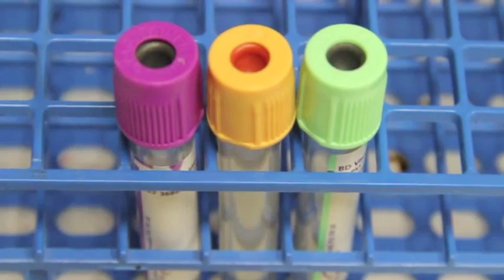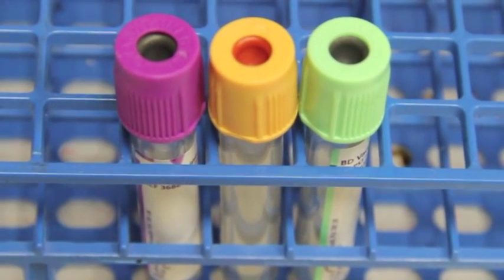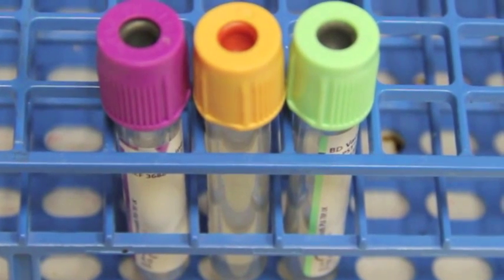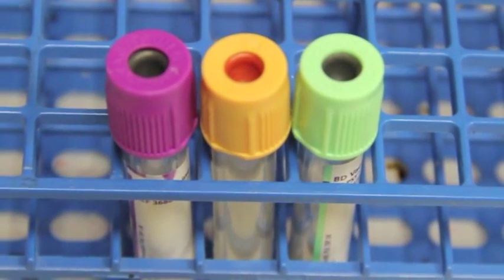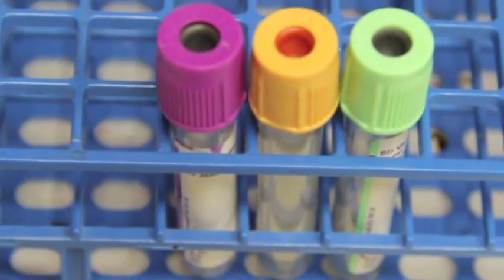The latex-free rubber tourniquet is disposable, as single use is recommended. The vacutainer tubes that the blood is collected in have different additives to either prevent clotting or enhance the clotting process. The types of vacutainers used will be according to the test orders that your physician has requested.